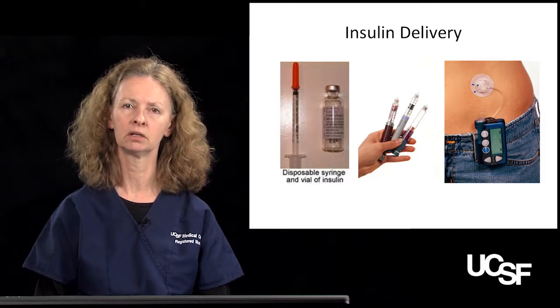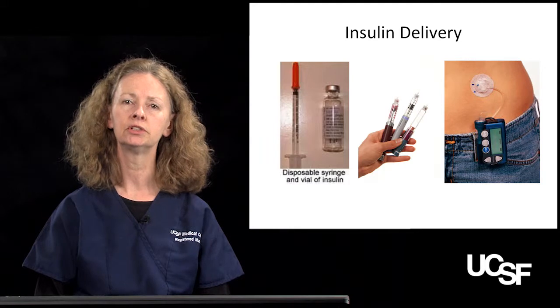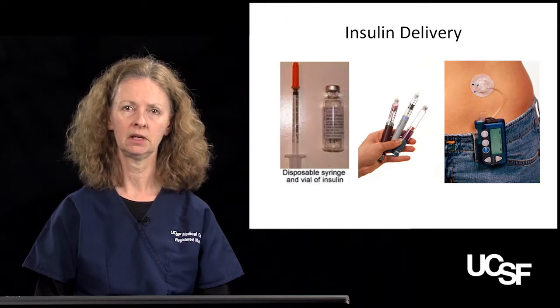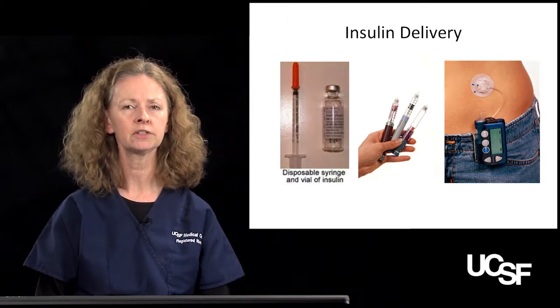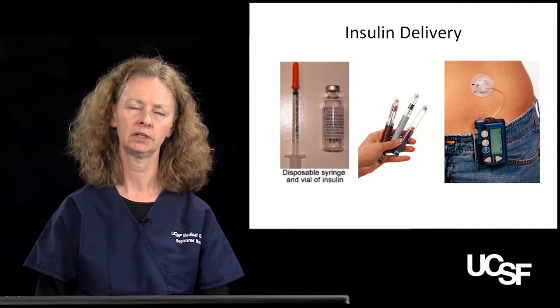Certainly there are some disadvantages to wearing the pump. They are expensive. Most insurance companies will cover an insulin pump, but they do require ongoing supplies, and we encourage patients to also have a backup to be able to give themselves insulin if for some reason the pump fails or something happens to the infusion set.